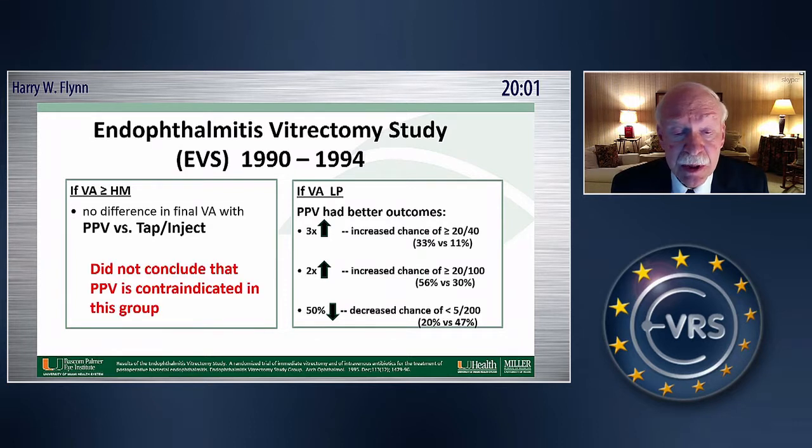Next slide, please. However, this study did not conclude that vitrectomy is contraindicated for eyes with better than or equal to hand motion acuity. Today, I continue to use vitrectomy in more advanced cases, and I'm not restricted by this study and its result. Next slide, please.